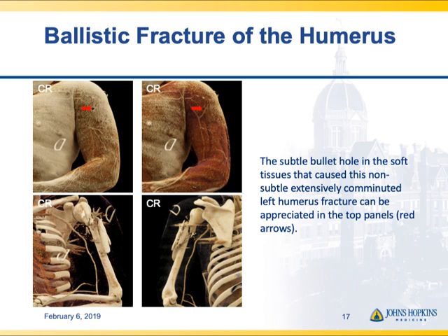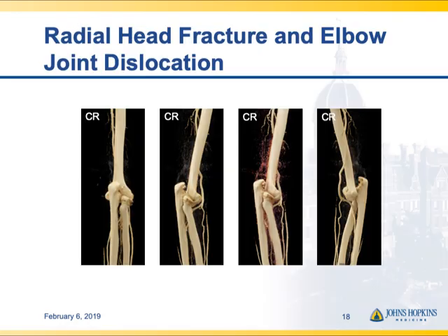This patient doesn't look like much on the top panels — a fairly small soft tissue injury — however this was a bullet wound, resulting in a very comminuted ballistic fracture of the proximal humerus. Most striking is that even with significant metal artifact from bullet fragments, we can still nicely see all the fracture fragments, and the artifact doesn't prevent us from creating useful cinematic rendered images.